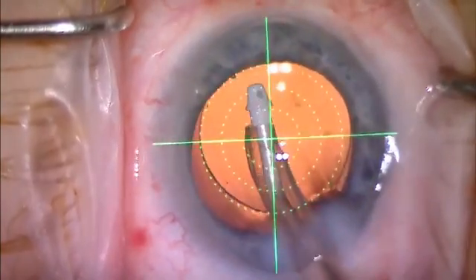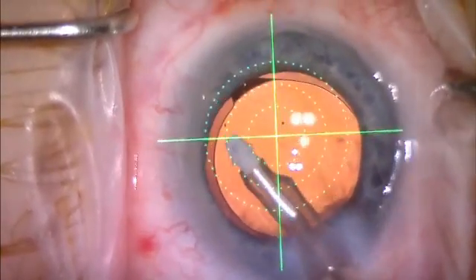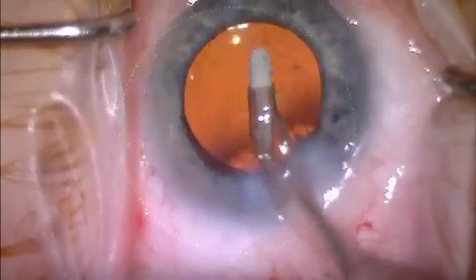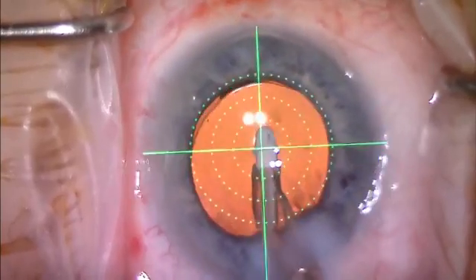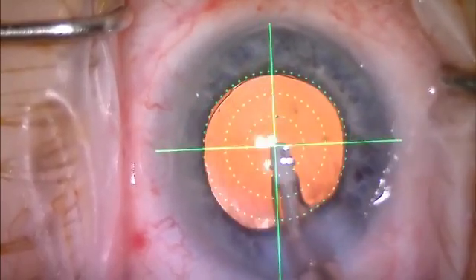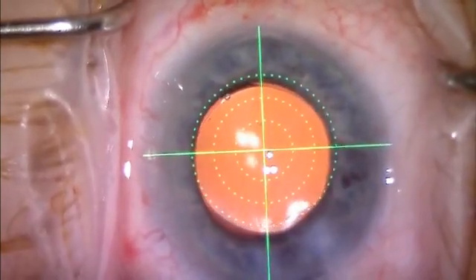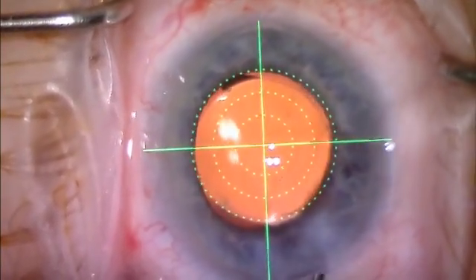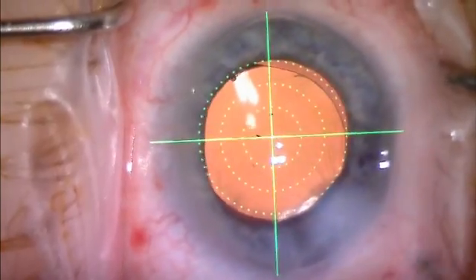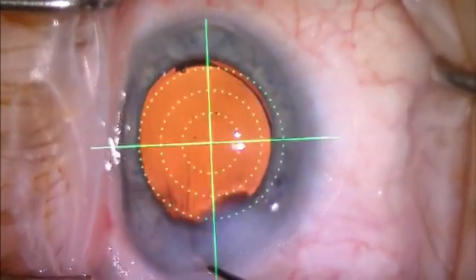I have found personally, however, that as much as we would like to think we can place this lens and it will stay, as soon as we hydrate the incision and fill the capsular bag and anterior chamber, these lenses do have a mind of their own and will tend to center on the equator of the capsular bag. Therefore, now instead of just nudging the lens a little bit nasal, we can actually rotate this lens until we find that part of the bag that it centers the best in.